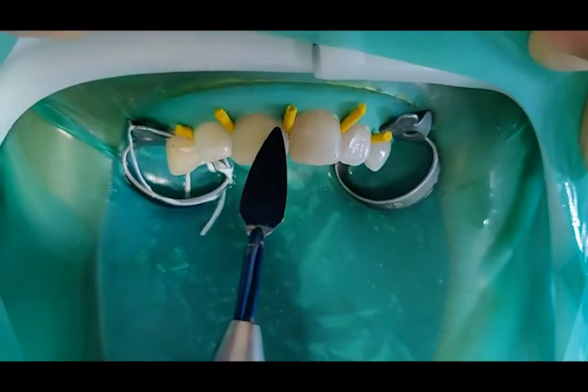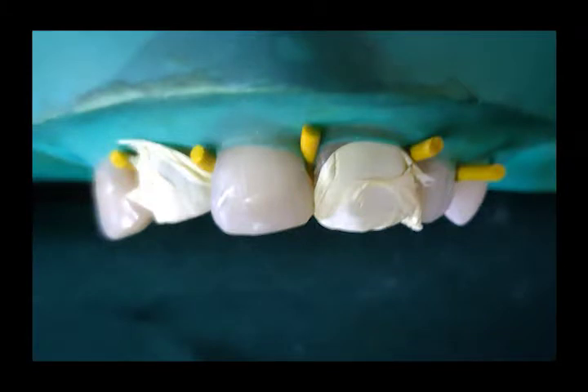The second dentine layer is placed, followed by curing of the layer. Plumber's tape was used to isolate and visually enhance the tooth, as it drapes and helps in proper shaping of the composite to the proximal aspect of the adjacent tooth.